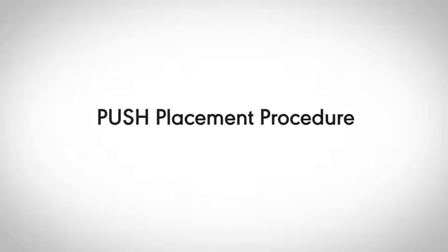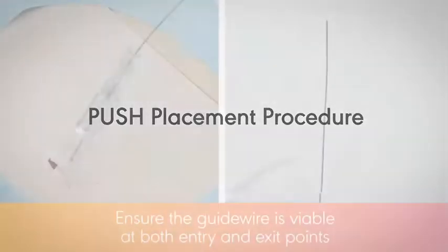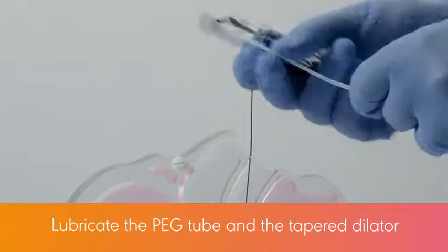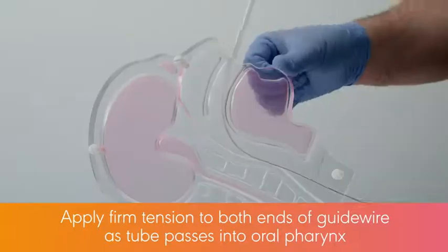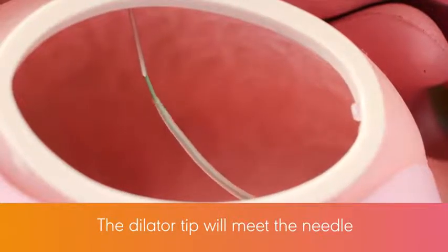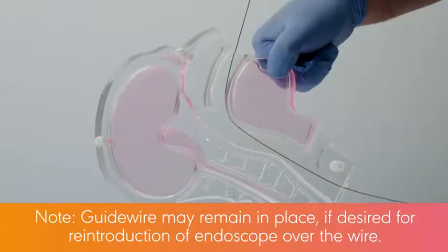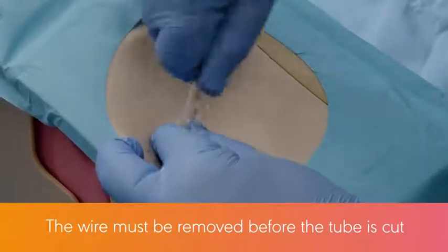Procedural steps for the push technique are the same as the pull technique until the guide wire is being pulled from the mouth. At that point: ensure the guide wire is viable at both entry and exit points. Straighten the tapered dilator portion of the tube prior to sliding it over the guide wire. Lubricate the PEG tube and the tapered dilator. Advance the dilator tip over the guide wire — firm tension must be applied to both ends of the guide wire as the tube passes into the oral pharynx. With the guide wire under tension, the dilator tip will meet the needle and push it through the anterior abdominal wall. After the dilator portion exits the abdominal wall, remove the guide wire. Note: the guide wire may remain in place if desired for reintroduction of the endoscope over the wire, but must be removed before the tube is cut.